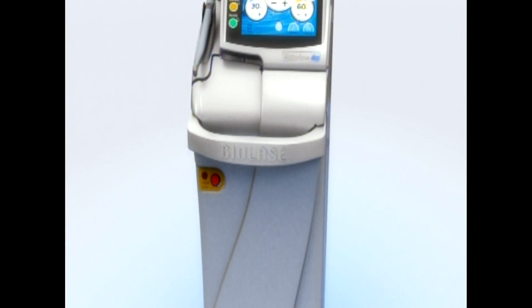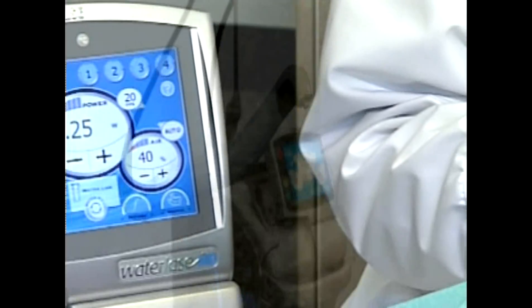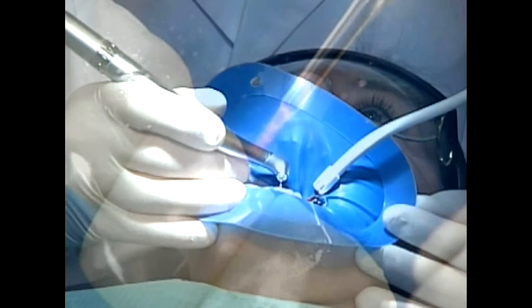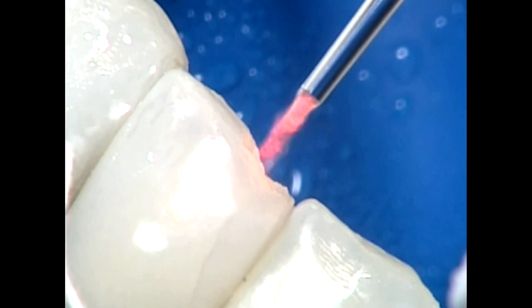Why use the Waterlase MD laser instead of the high-speed drill to do operative dentistry? Because with the laser, there is no vibration, no detrimental heat to the tooth. The laser is a gentler, better way to treat and preserve the tooth structure.